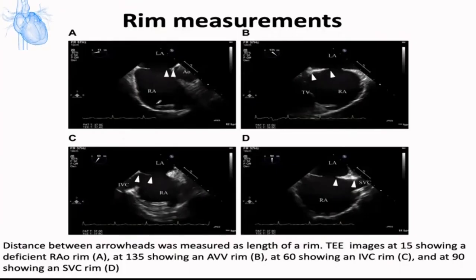Measurement of rims: from this point to this point, this point to this point — this is the SVC rim — and this point to this point. We should measure the rim in this way.